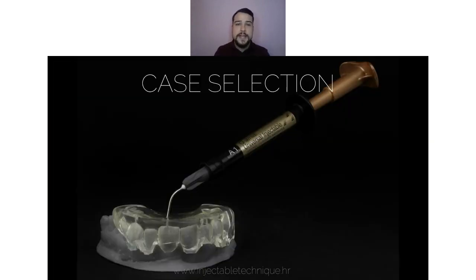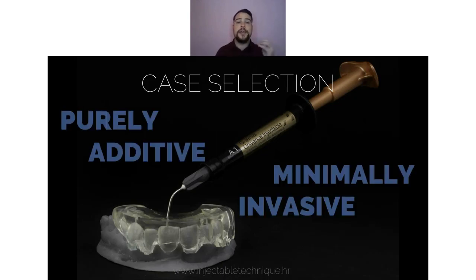Now, let's discuss the indications and which cases are suitable for this technique. For me, it is very simple. All of the cases that you will find on my educational platform, some of which are covered with clinical photos of real cases, and all cases that you can find on my social media, in my lectures, or in this webinar, are done purely additive and minimally invasive. By purely additive, I mean without preparing the tooth.